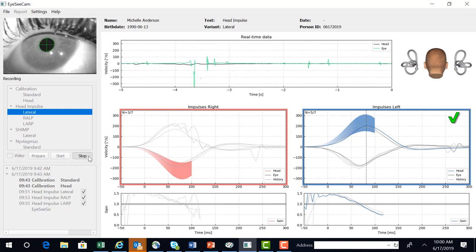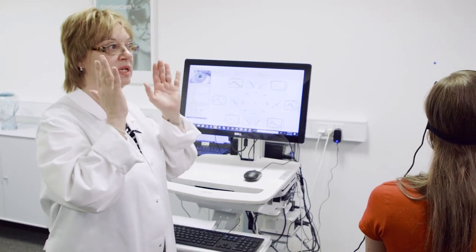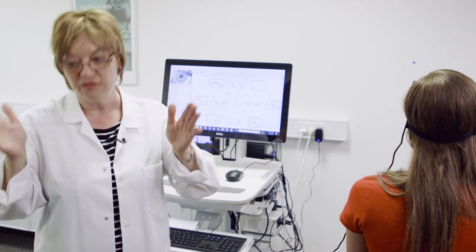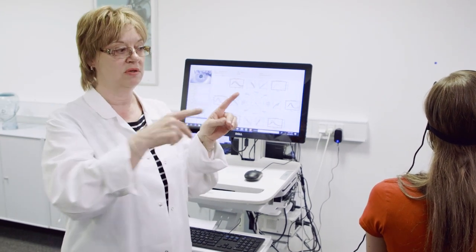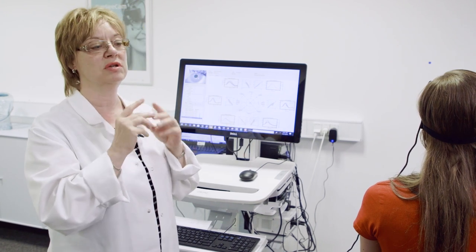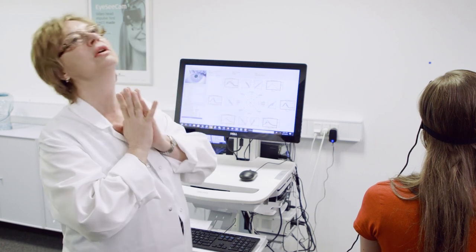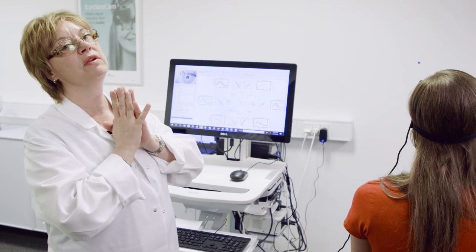For vertical canals, for testing the vertical canals it works very much the same, only for the vertical canals they'll be thrusting in a 45 degree plane. And so just for example I'll show a LARP, which is a left anterior right posterior. So I'll thrust over the left shoulder for the left anterior and come back over the right for the right posterior.